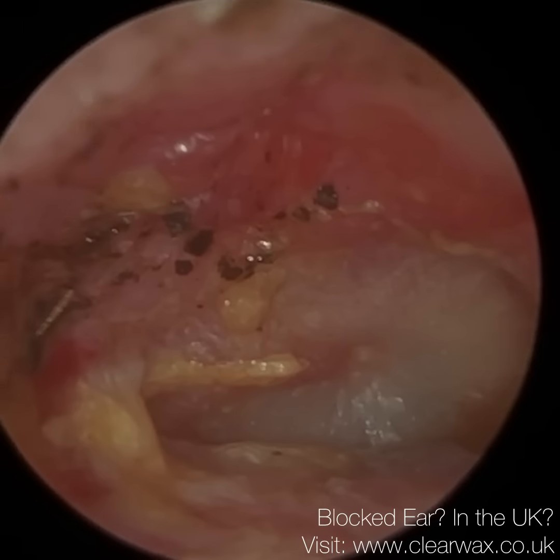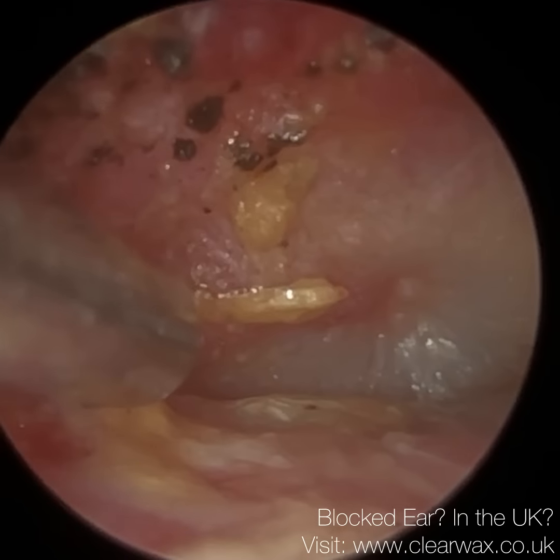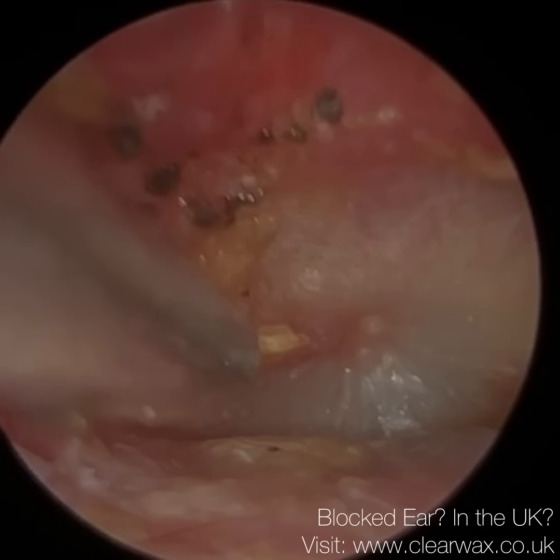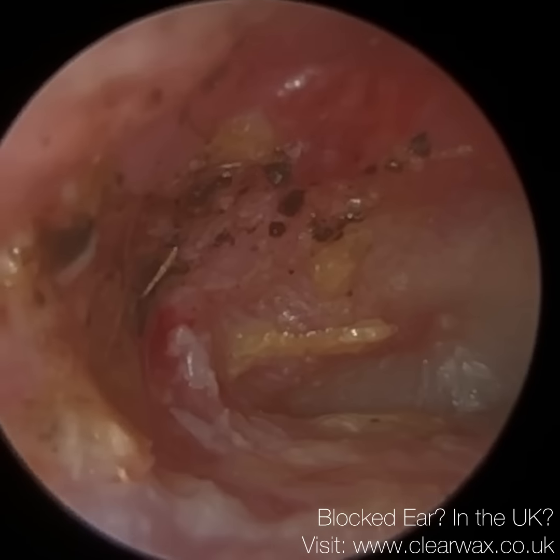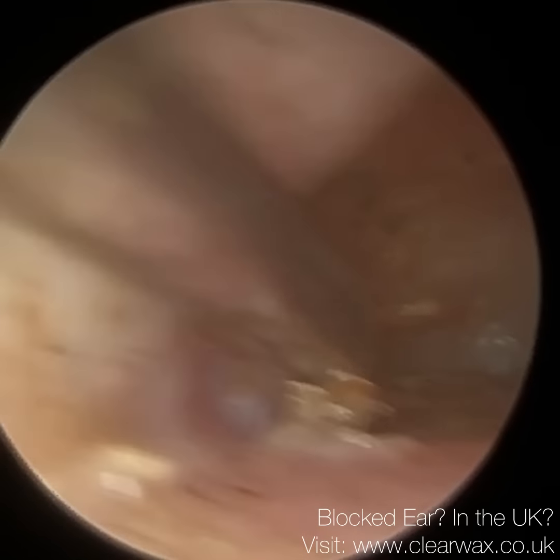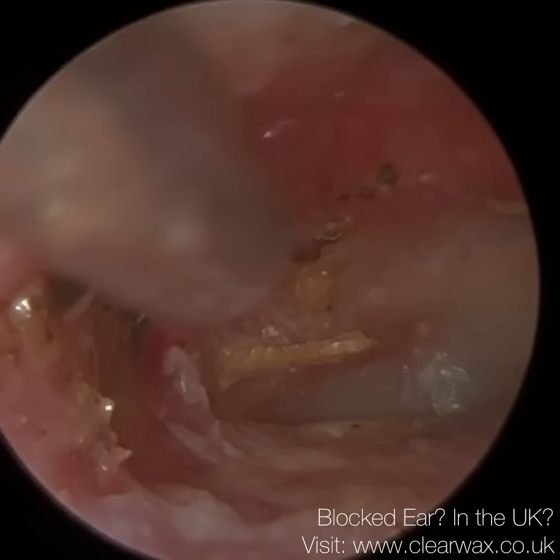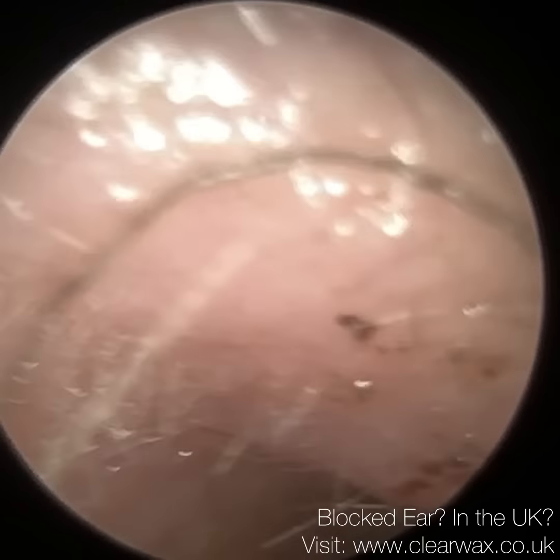So yeah, in an ideal world, I like to remove all that, but sometimes it's not always possible because you've got to take into account patient comfort, which is, for me, the most important thing when you're performing earwax removal, is to ensure the patient's always comfortable, or as comfortable as possible. I think the patient just found it slightly uncomfortable in this region. This is where it's quite tender.